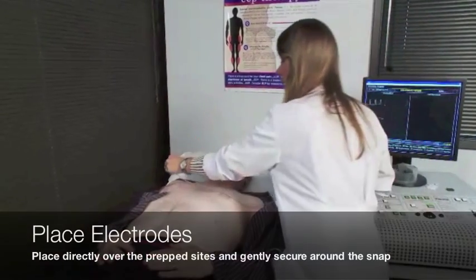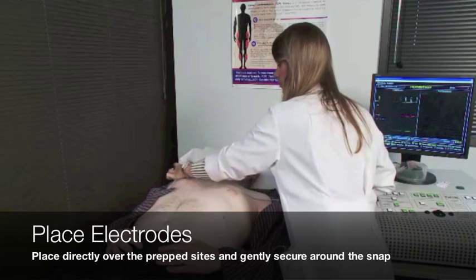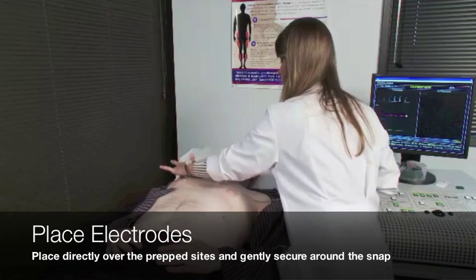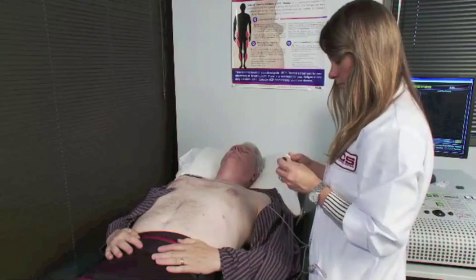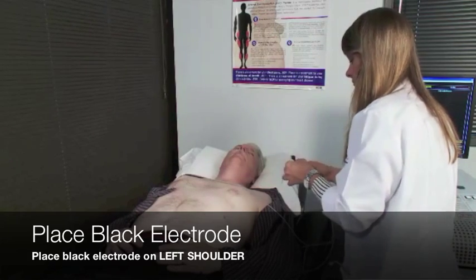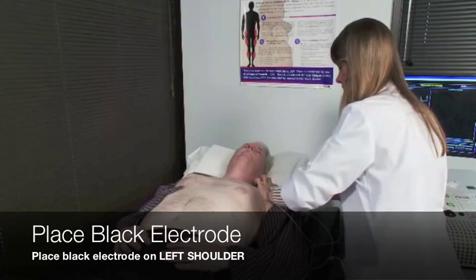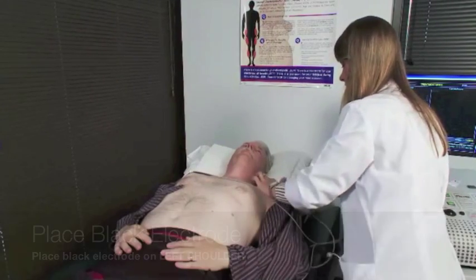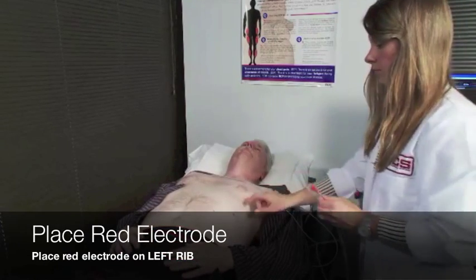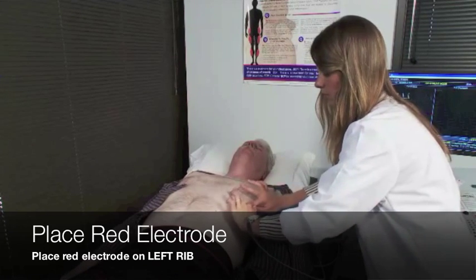Now, place the electrodes directly over the prep sites and gently secure around the snap. The white electrode is placed on the right shoulder. Next, place the black electrode on the left shoulder. Finally, place the red electrode on the left rib around the V4, V5, or V6 position.